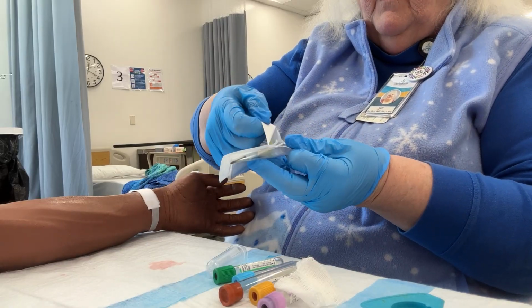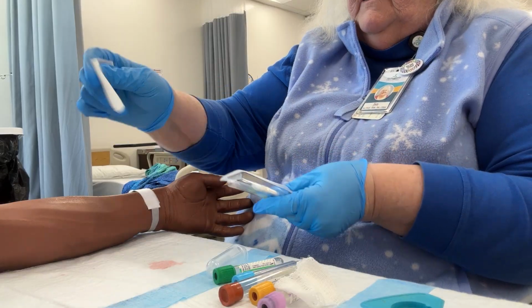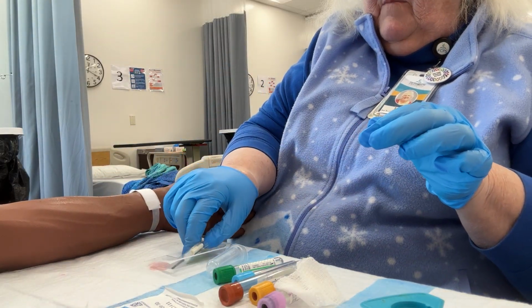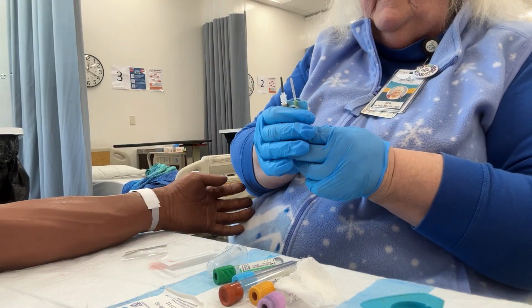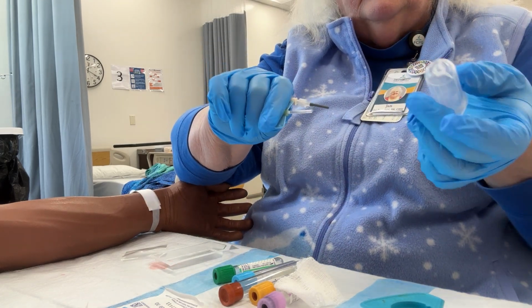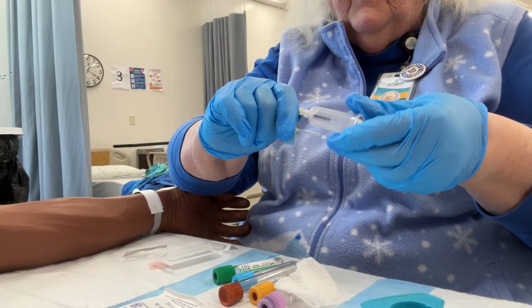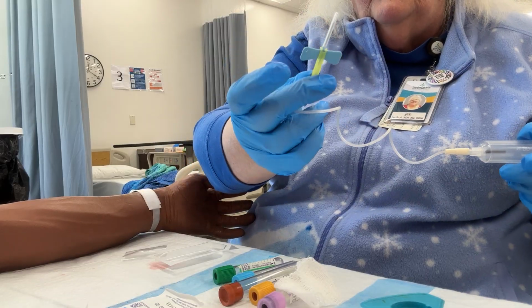So I'm going to peel it apart, and I'm just preparing my equipment while that alcohol dries. I'm going to tear this off, but I'm going to keep my lid because I need that for documenting my needle size for my charting. I take my needle out, and I usually just take the plastic off, but I keep both pieces in my hand. Then I pick up the holder, and I need the small end of the holder to go onto the butterfly apparatus. The end with the blue has these wings, hence the name butterfly.